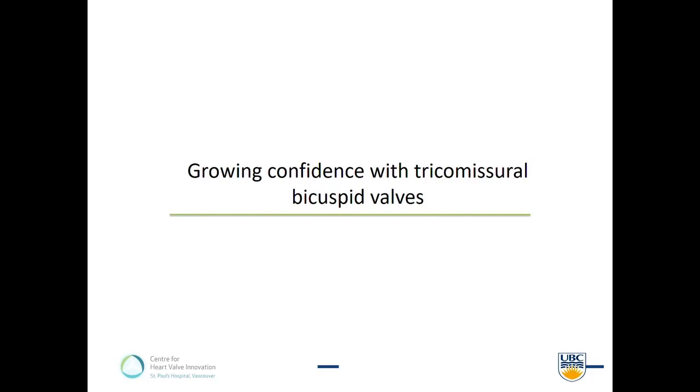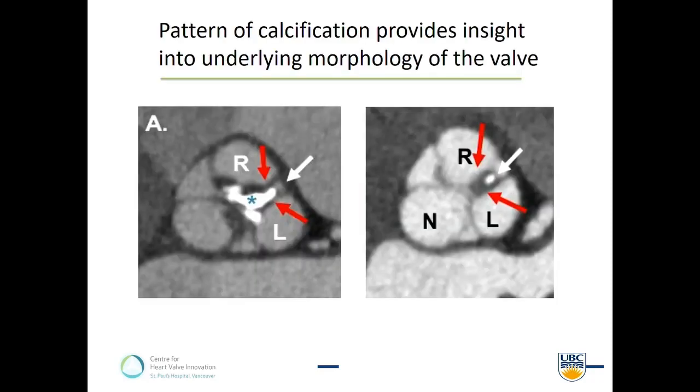What we have seen is that there's growing confidence with either asymmetric cusp fusion, functional bicuspid, or as Hassan Jilaihawi called it, tricommissural bicuspid valves. We see cases like this that we just look at and we say, this doesn't look like a typical valve morphology. There's calcium in between the cusps, suggesting that perhaps the calcium is being deposited in some sort of fibrous bridge that the patient was either born with or developed over time, but presents later in life. Another limitation of our historical bias is that you can't have a congenital abnormality that presents at 82. But of course you can if it's just on a more modest spectrum of disease.